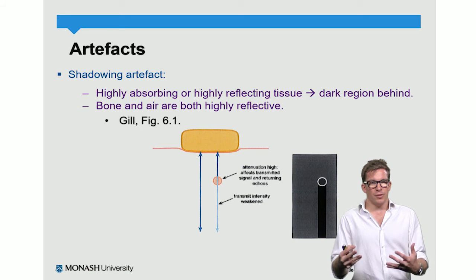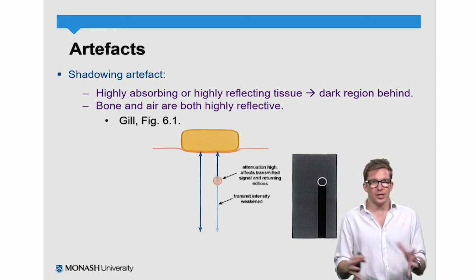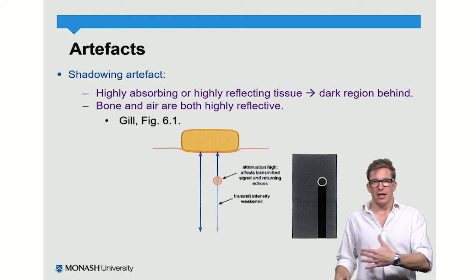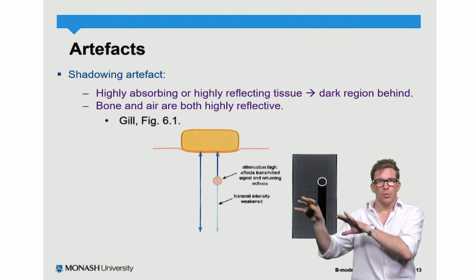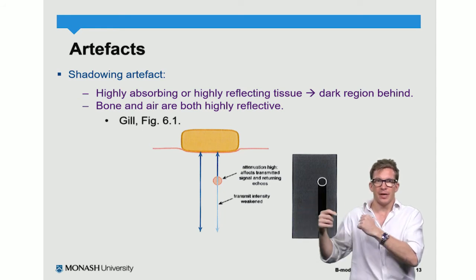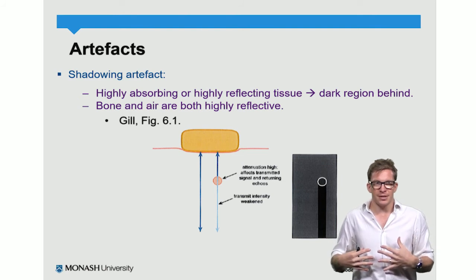Right, so once we've got the display and we're looking at the display, we have to try and understand what it is we're actually looking at, and that's where a significant portion of the training in ultrasound comes in. So if I give a child an X-ray image, a small child would be able to tell me roughly what the different parts of the X-ray image show, because it's very intuitive to look at an X-ray image and correlate that with our knowledge of human anatomy.